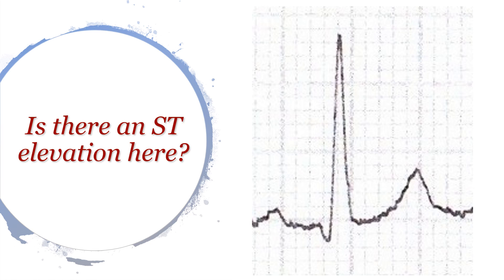What do you think about this particular complex? When we say ST elevation, what I mean is: do you think the J point is above the baseline, at the baseline, or below the baseline? The J point is the junction between the end of the QRS complex and the beginning of the ST segment. If this point is above the baseline, this is ST elevation. If it's at the baseline, it's isoelectric. If it's below, it's ST depression.